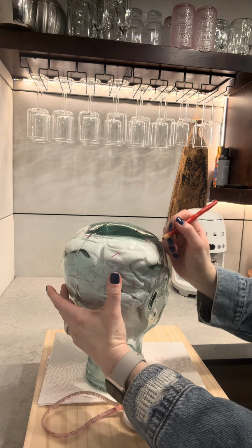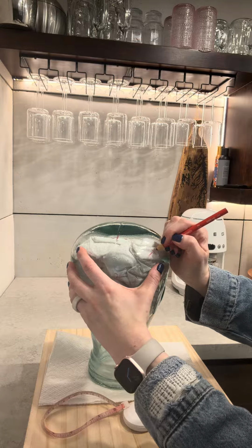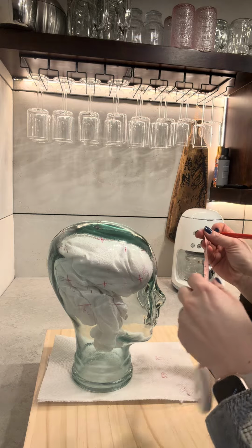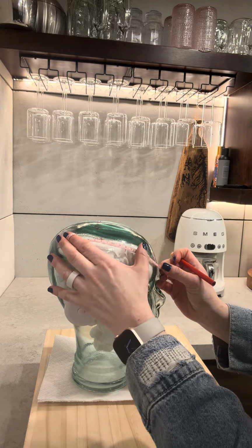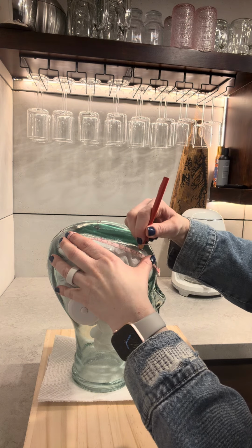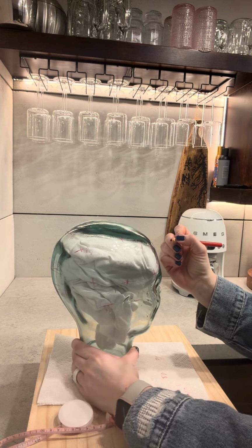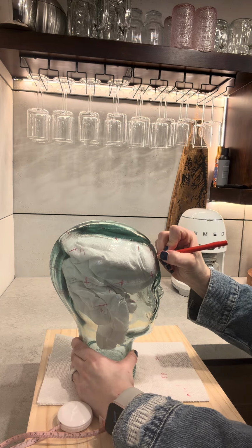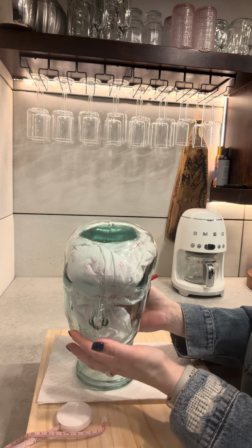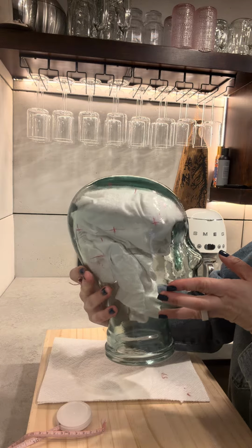And that's my true C4, P4, now from Fp2 to C4, and that is my true F4, and that's my complete measurement. I don't know if it's visible, I hope so.